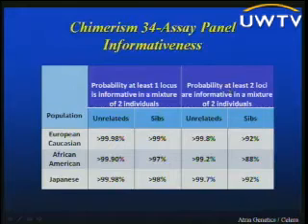And as I said, we are generally gun shy of using 1 locus for sure. When 2 makes us uncomfortable, we'd rather have more. And we have asked the company to give us information on what happens if you're looking at 3 loci, and I've never received that information, which leads me to believe that it's probably not very good.